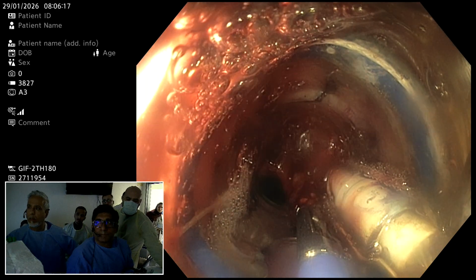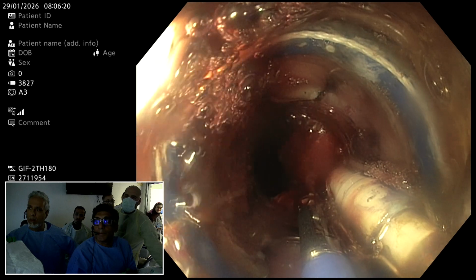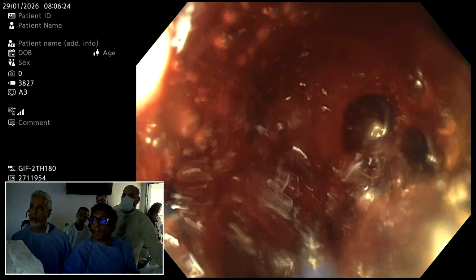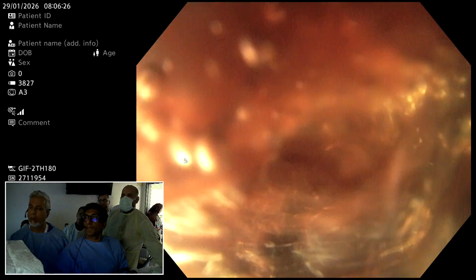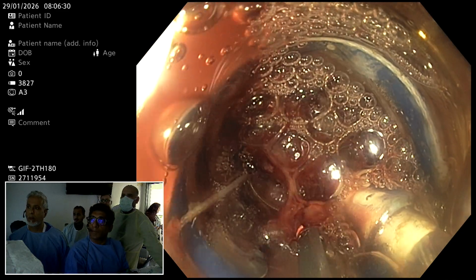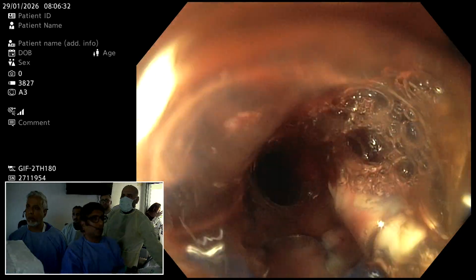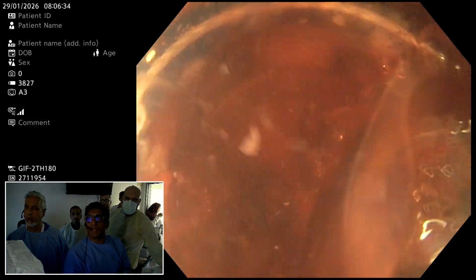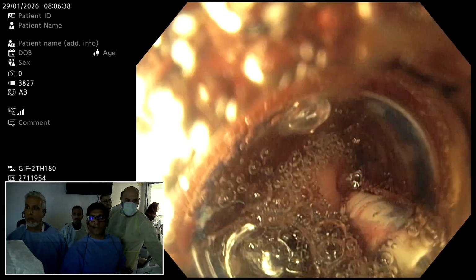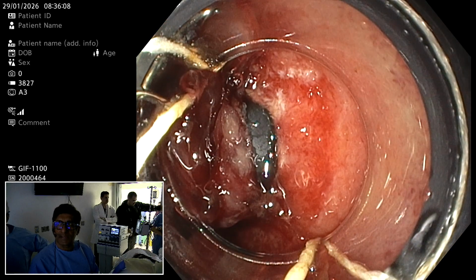No, it's not coming. No. Yeah, you can change and then I'll see. To cut off the blood supply.